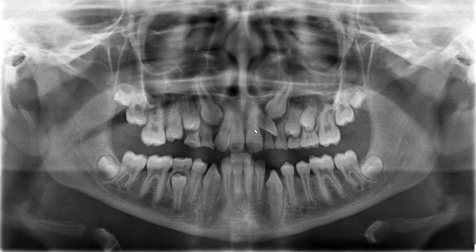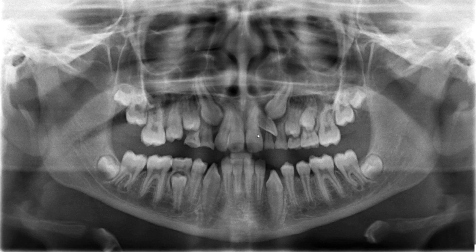Let's look at the relationship between central incisor and lateral incisor, 9 and 10. They appear superimposed, overlapped with one another. What is the precise spatial relationship between the two? Is there resorption caused by either of the teeth, or is it causing displacement of any one of these teeth? Is the lateral in front of the central or behind the central? All of these questions cannot be readily answered from this single radiographic image.